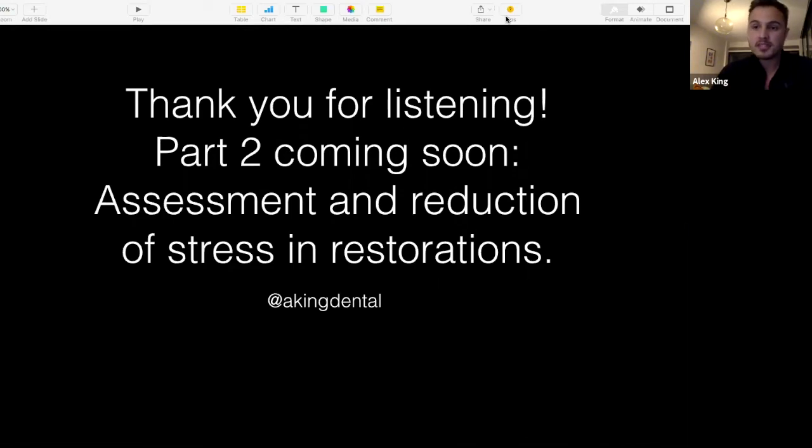However, there are some dentine bonding agents out there, possibly some of the ones I discussed, that do have MMP deactivating compounds in them. But the ones that you'll be using in dental school, and in a lot of practices as well, are not gold standard bonding agents. So you'll have to deactivate with chlorhexidine yourself. It just depends on the one you use. I think that's what she was asking. But as a rule of thumb, use chlorhexidine after you've etched. So etch, rinse off, chlorhexidine on a cotton wool pledget, rinse off, dry, bond.